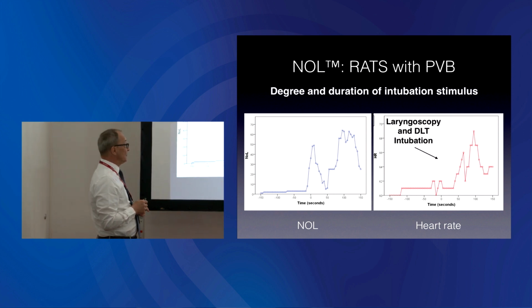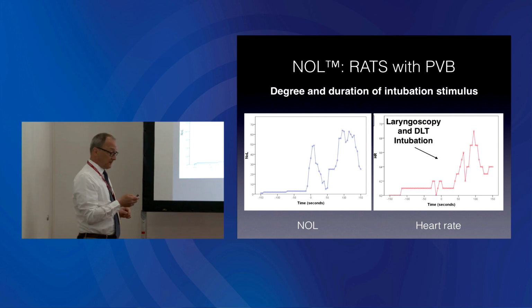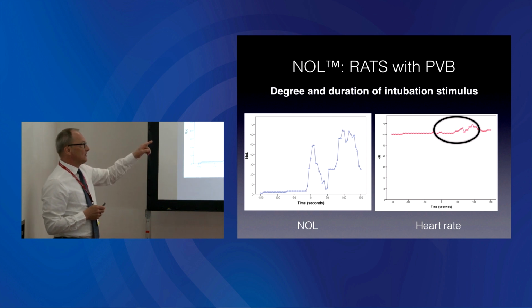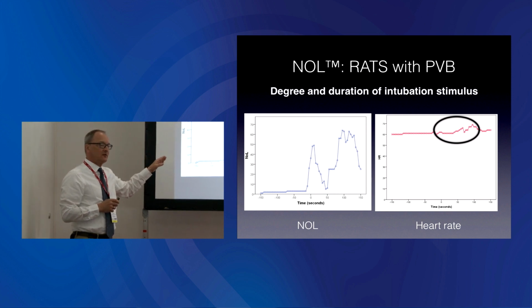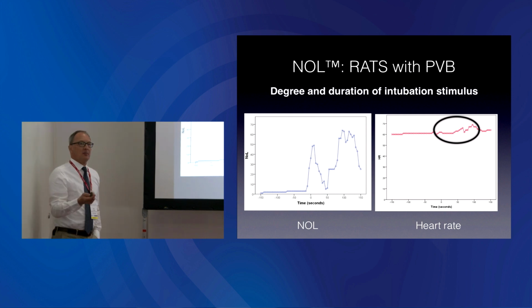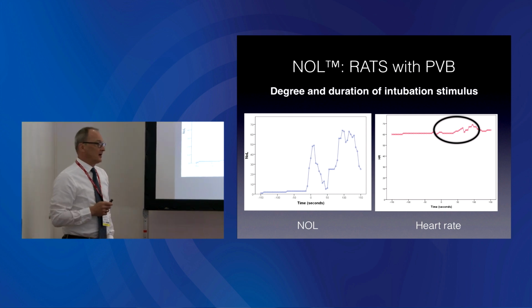And if you are honest, the actual heart rate changes are minimal. These are the changes that you had on your anesthetic record system, and you would probably not notice them in response to a stimulation, because they would be amongst other variables and amongst the noise.